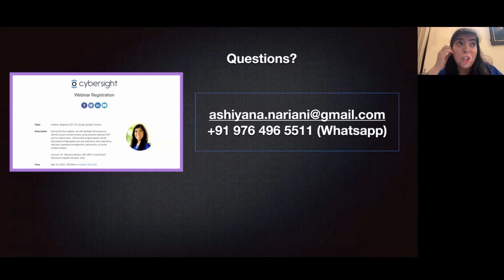So I would encourage you as an exercise, if you have anterior segment OCT accessible in your practice, wherever you are in the world, to go ahead and take images of whatever you're seeing. It could be just a random corneal lesion, a Salzmann's nodule, a pterygium, what have you.